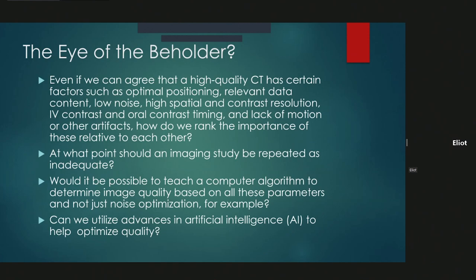The other really key question is, at what point should an imaging study be repeated as inadequate? One of the things that we've seen in the past is that technologists are actually much more likely, when asked and shown a CT image, to suggest that it should be repeated in comparison with a radiologist. Different radiologists in different practices may have different thresholds as to what is an adequate examination, even if they're pretty much perceiving the examination the same way, and as far as the criteria for repeating an examination as well. In some settings, it's much easier to repeat. In other settings, it's much more difficult.